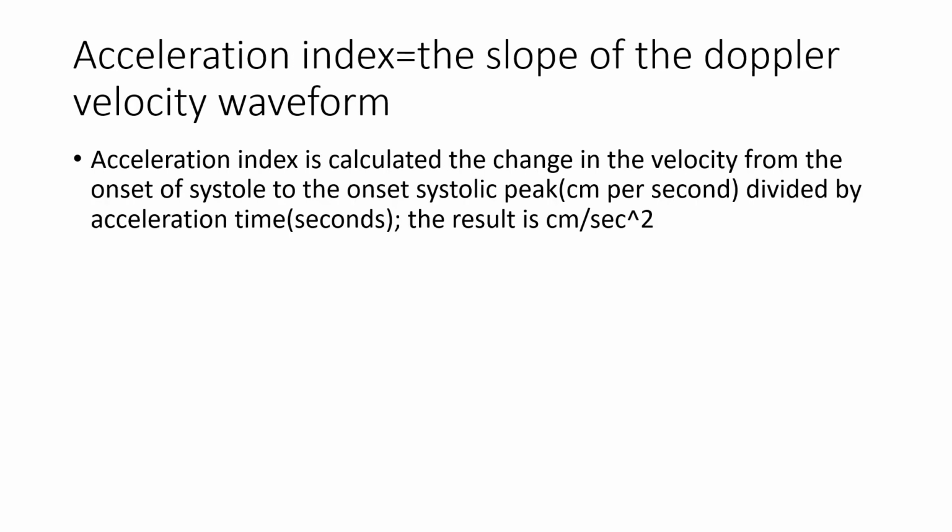Okay, we have here on the y-axis velocity, or changes in frequencies, and we have time on the x-axis. So we have a dampened waveform, high diastole, very prolonged acceleration time, a round peak, and then it comes back to a very high diastolic flow. Sorry about the drawing, that is very bad.